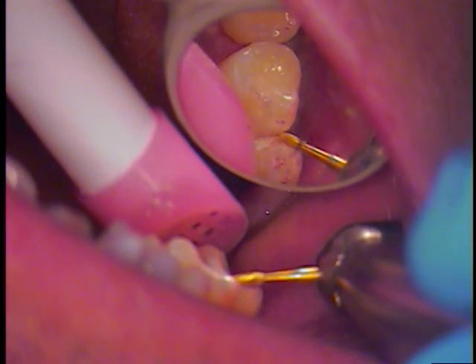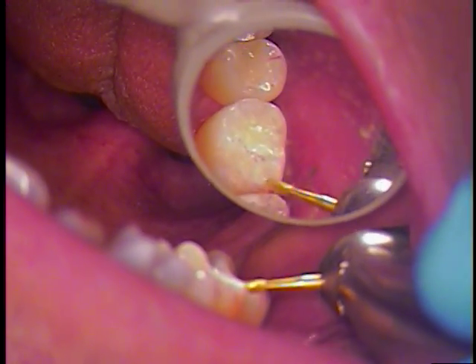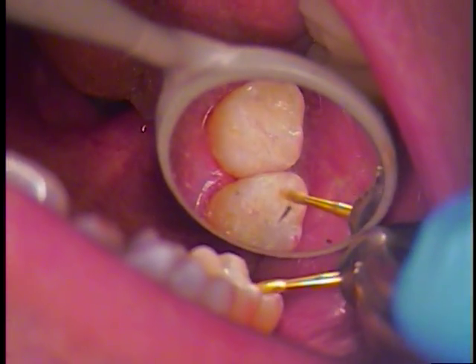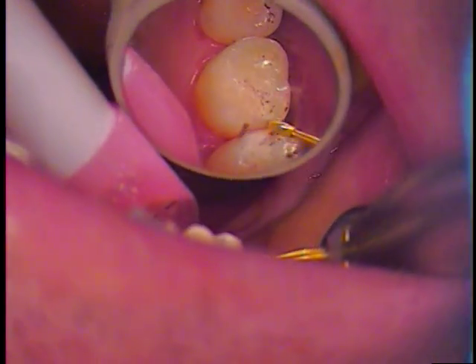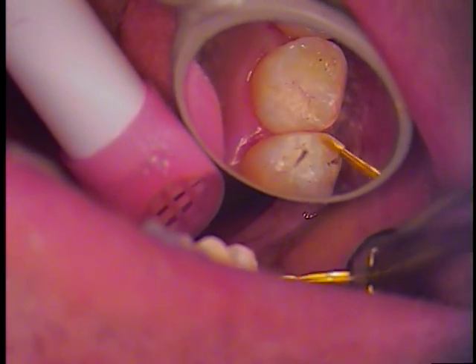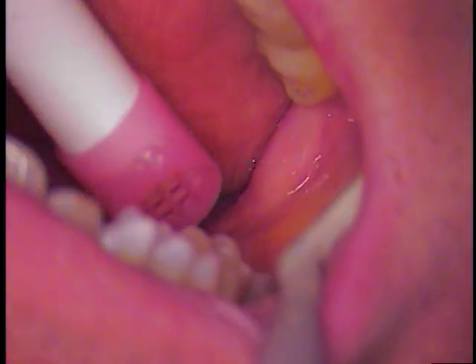It still feels a little high - we'll adjust it again. Close, slide your teeth on that spot, okay, open. Let's change the paper up a little bit, maybe move it around to get a better mark. We have a real flat facet that we cannot avoid because of the way his bite is. Bite down, slide - just let me know when it gets better. Open. Close again, slide again - better now.